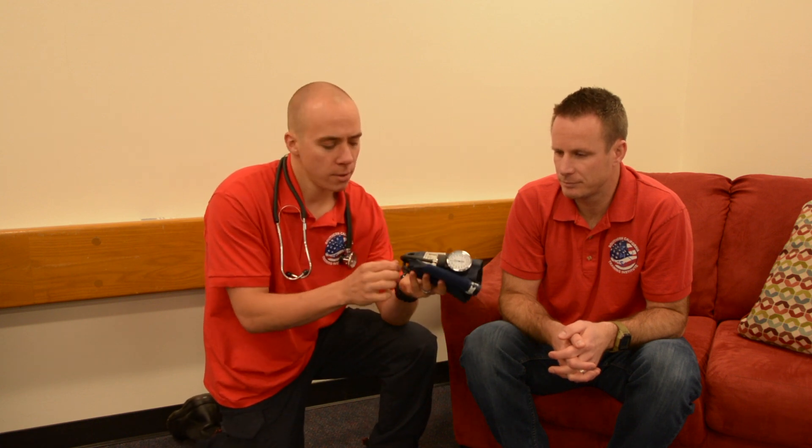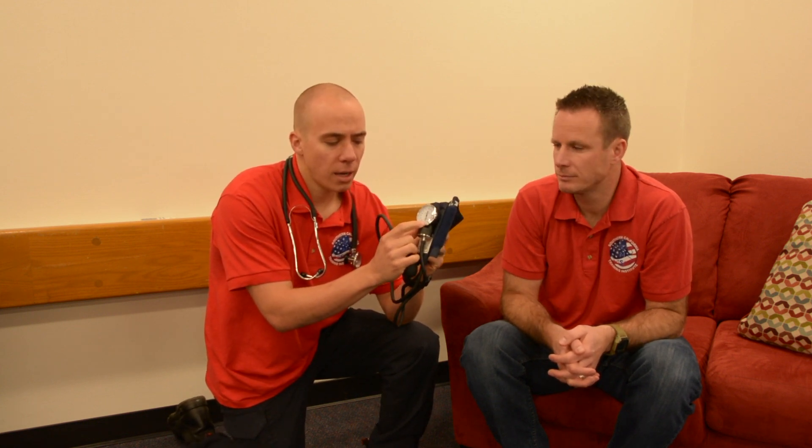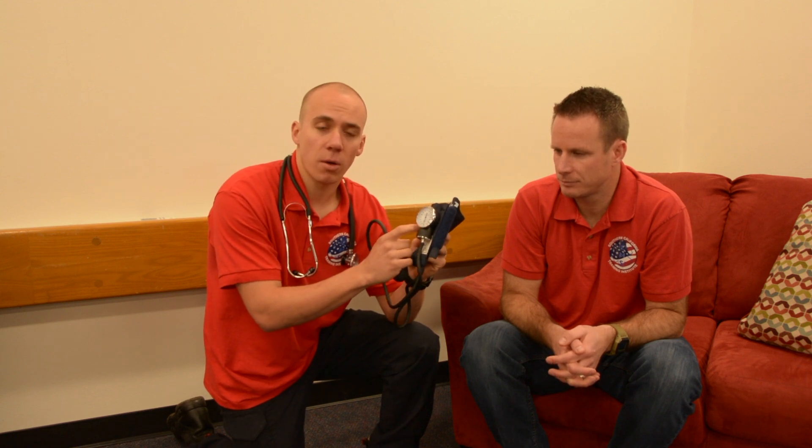The next thing is you have to make sure you check out your equipment. Learn from my mistake and check out your equipment before each and every call, especially in the morning before you start your day, because sometimes your equipment will be faulty and you won't be able to take a blood pressure. For example, when checking your gauge needle, you want to make sure that the needle is within the rectangle on the bottom of your gauge. If it's anything above or below that, you're not going to get a good reading when you inflate the cuff.